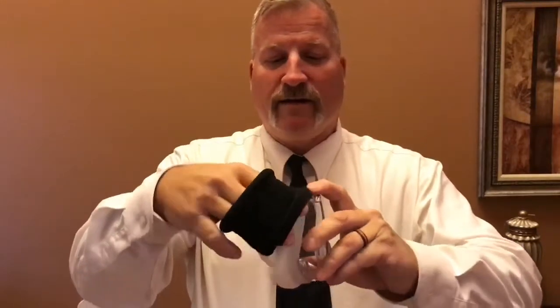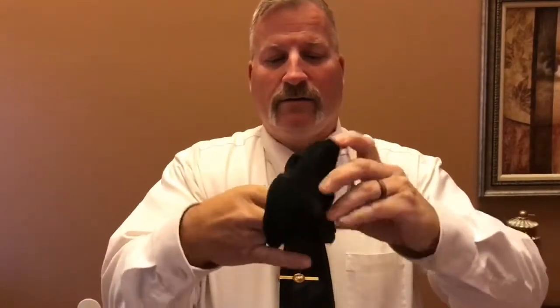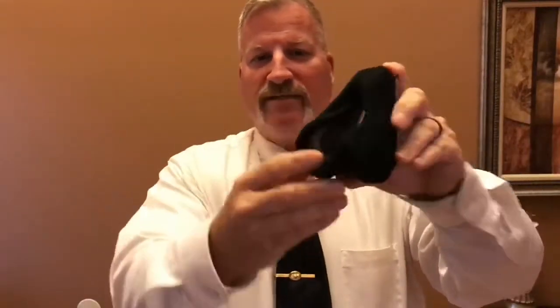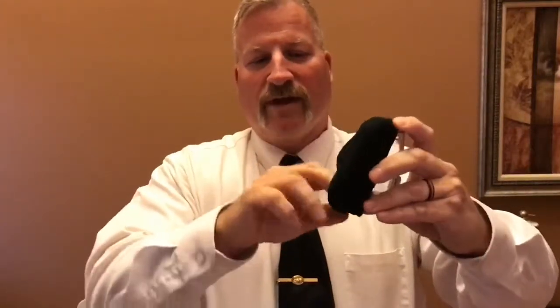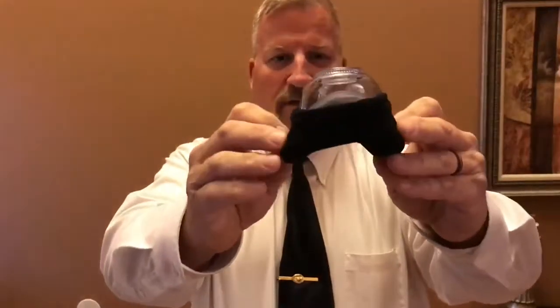What you're going to want to do is place a finger right here and hold all the way around until your comfort ring looks like this. You're going to push it inside the mask until the comfort ring grabs the back side, and it should look like this completely around your mask.